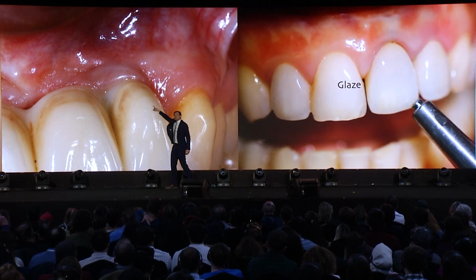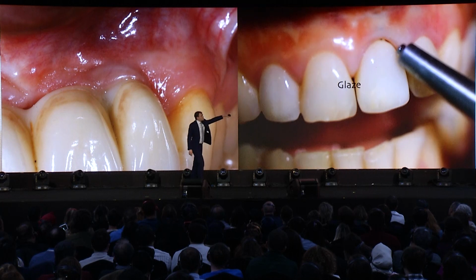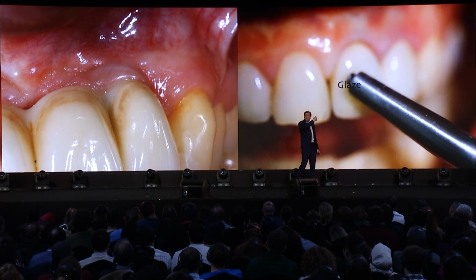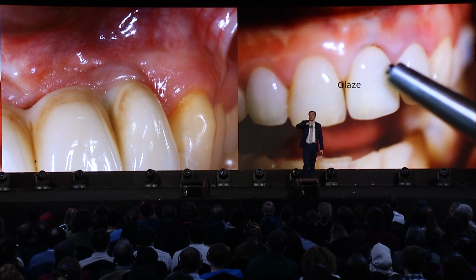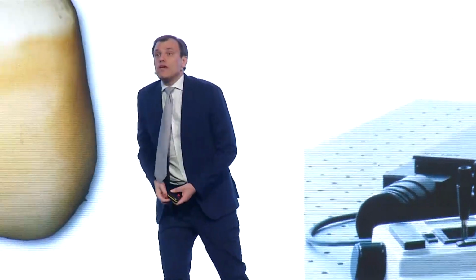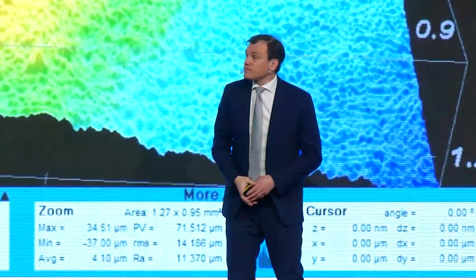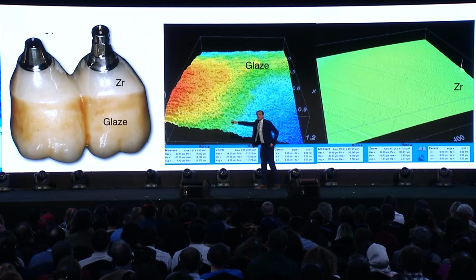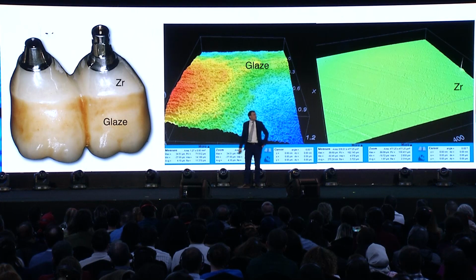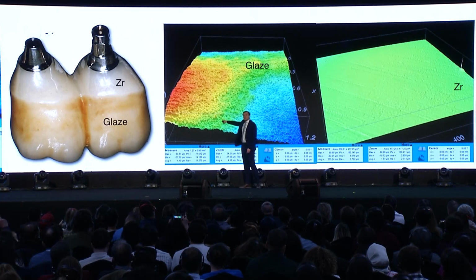This is how adhesion looks on the zirconia. Look, you don't see the sulcus. This is how adhesion looks on the glazed material. You can really probe it. You can see the tissues are raising, fluctuating. So surely there won't be any possibility to have a protection. This is a very cool image. Look how zirconia looks under magnification, and look how glaze looks under magnification.